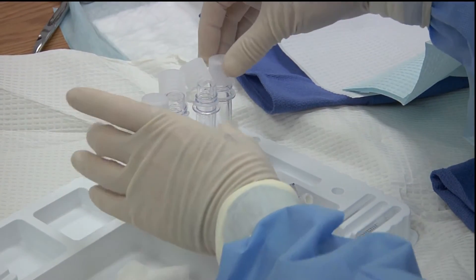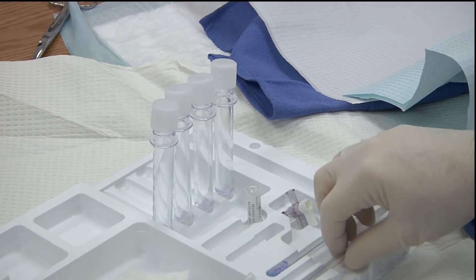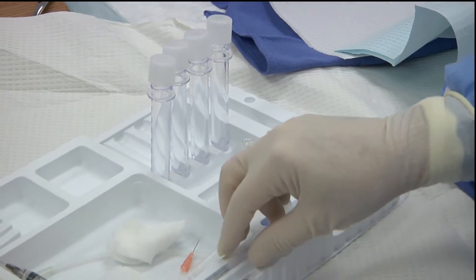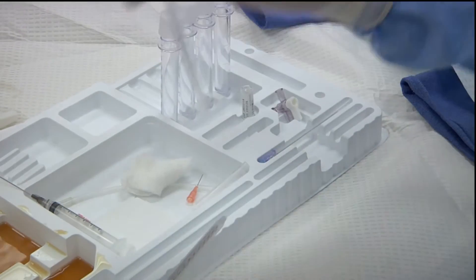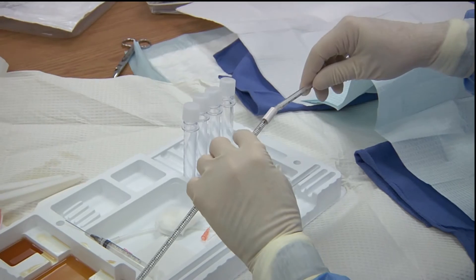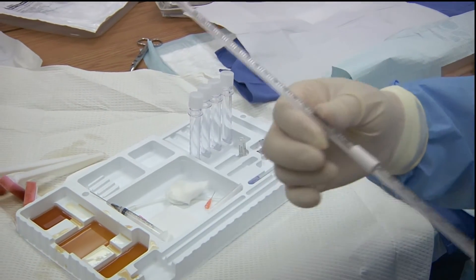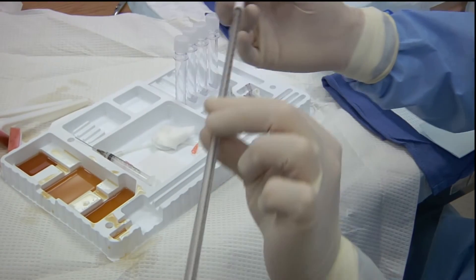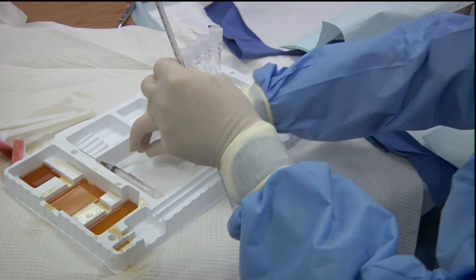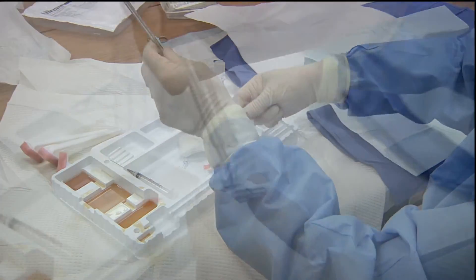Note that there are four plastic test tube containers for collecting cerebrospinal fluid. Get them prepared with the caps loose so they are ready to go once we actually initiate the lumbar puncture procedure itself. You will also be assembling the manometer so you won't have to fumble around with it when the time comes to measure opening pressures. We will also take the precaution of now hooking up the manometer to the stopcock itself.